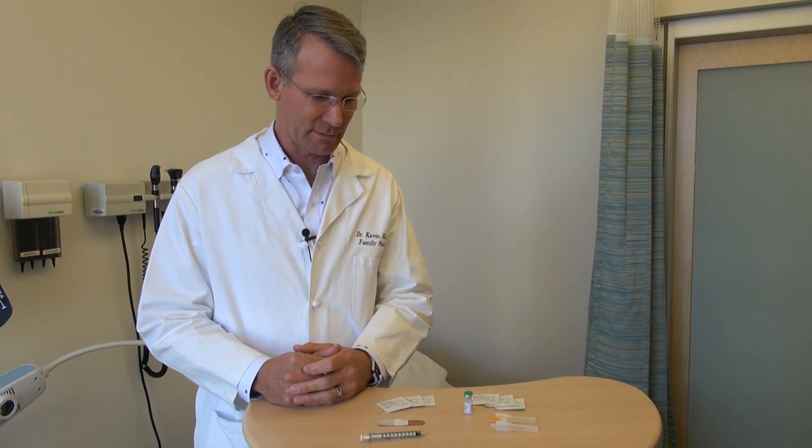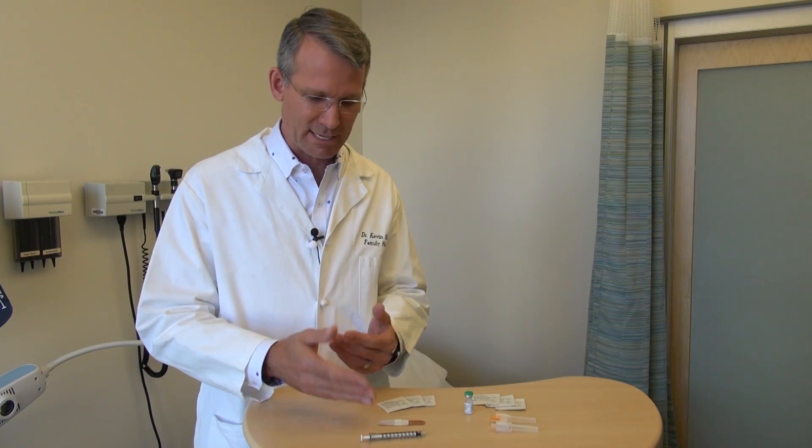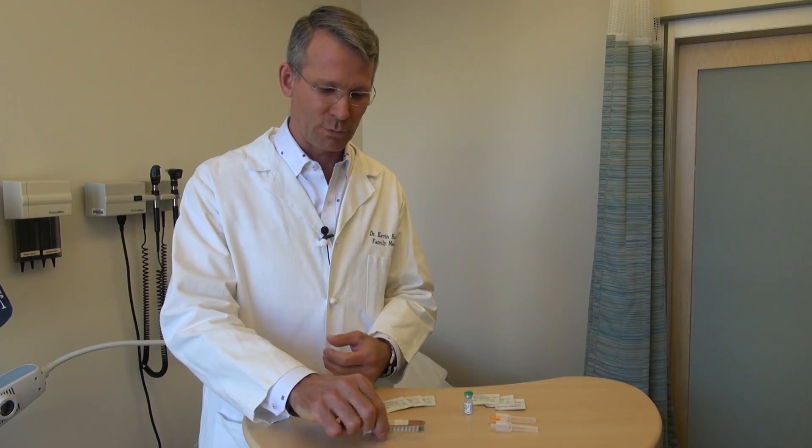We're going to go through the steps involved in drawing up the medicine, then we'll do the injection in just a moment. The first thing is you should always have your band-aid ready to go, and you would be unwrapping your syringe getting that all set.